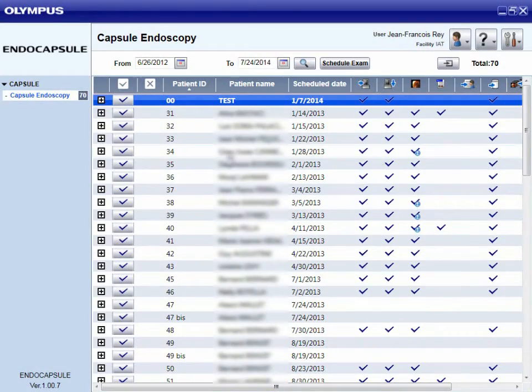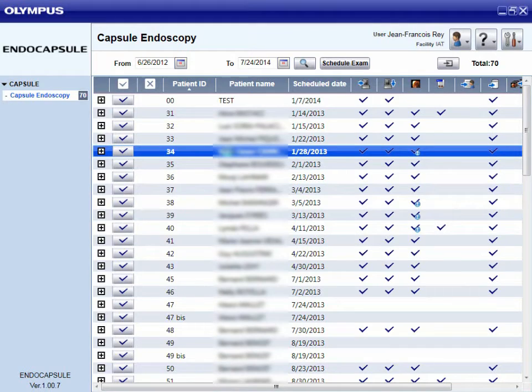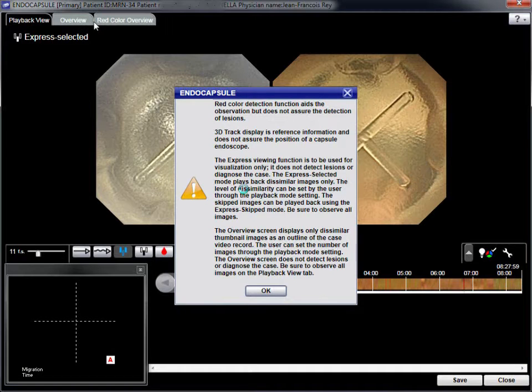The first step is to select the name of the patient from the list. This screen displays all of the features of the reading software, with the most useful for diagnosis being the express selected mode.